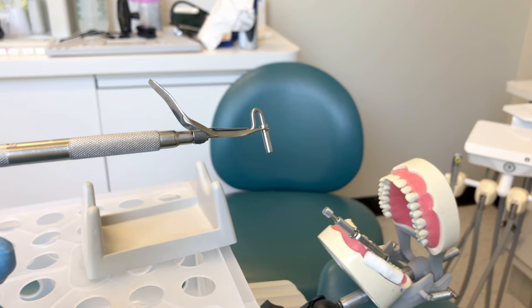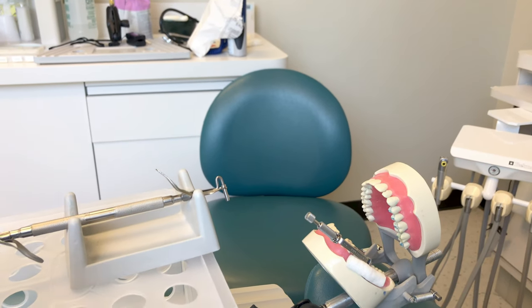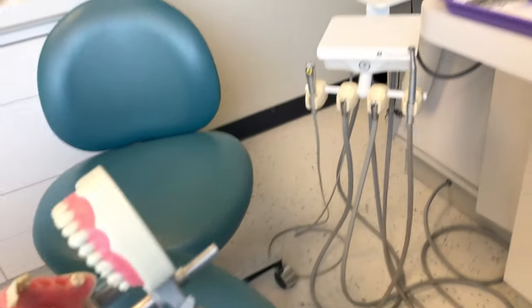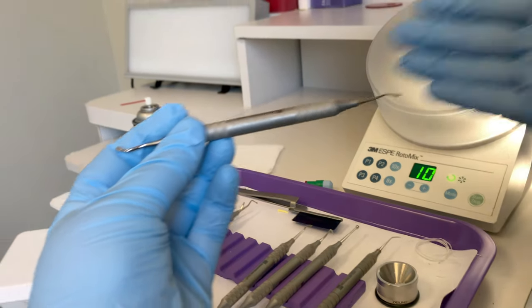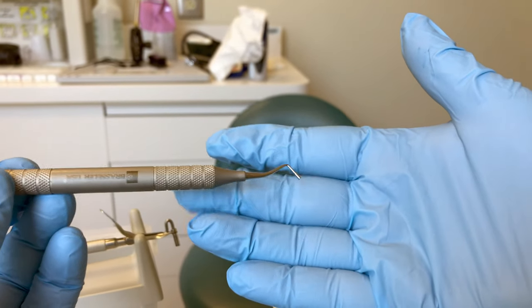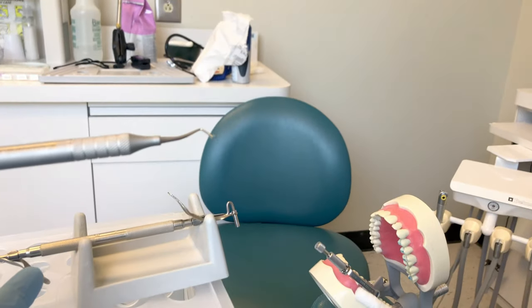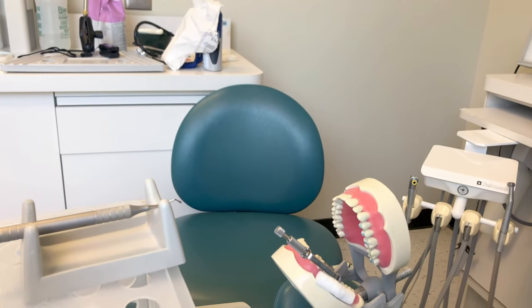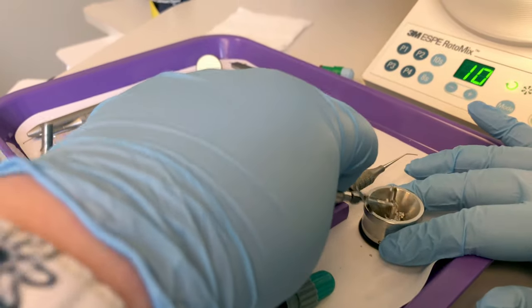When you deliver your carrier, deliver it in the direction of use. If we're working on a mandibular tooth, face your carrier downwards, and if it's double-ended, deliver the small end to the doctor. The doctor will need the condenser next once the filling is in the prep. Deliver the small end first unless your doctor specifies otherwise. Stick out your pinky to retrieve the used instrument and deliver the new instrument firmly into their hand. While they are condensing, we return to our well and repack.